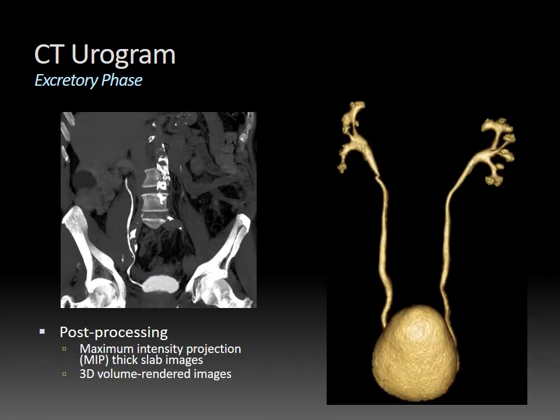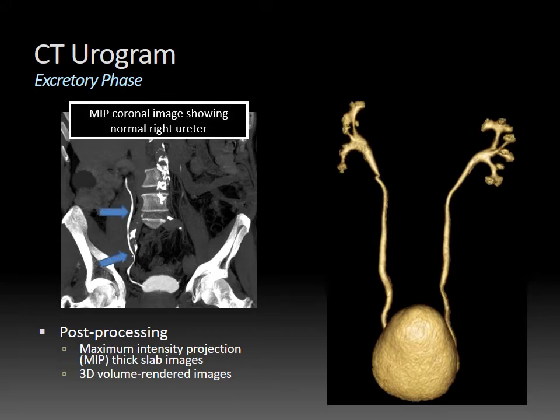There are various post-processing techniques you can do with CT urography. One is generating maximum intensity projection, or MIP, images with thick slab reconstruction. A MIP takes the voxels with the highest attenuation value on every view throughout a given volume and projects them onto a single image, displaying high-density structures like bone and contrast-filled structures preferentially. You can see the right ureter containing excreted contrast very conspicuously, as well as the bladder. You can also adjust the obliquity of these images to highlight a particular structure.